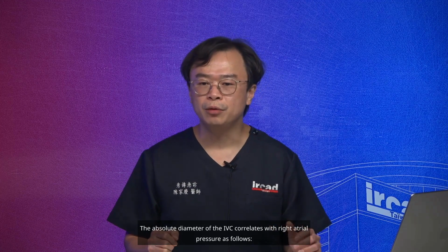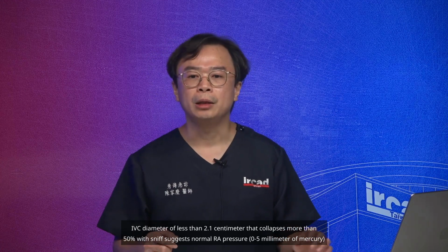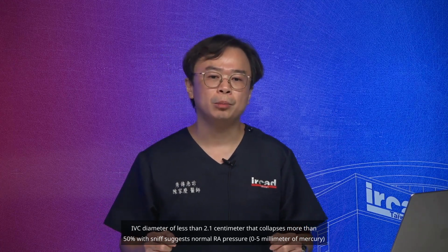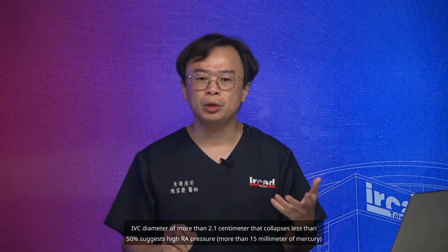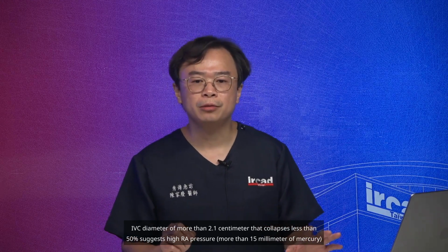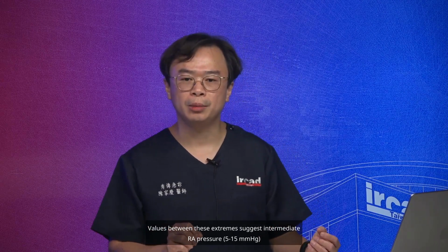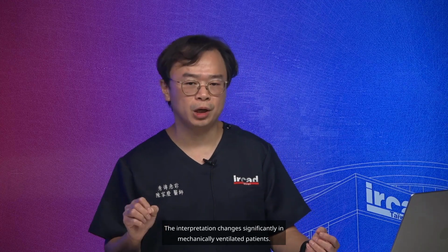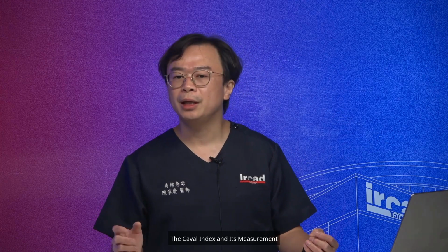The absolute diameter of the IVC correlates with right atrial pressure as follows. IVC diameter of less than 2.1 centimeter that collapses more than 50% with sniffs suggests normal RA pressure, 0 to 5 millimeter of mercury. IVC diameter of more than 2.1 centimeter that collapses less than 50% suggests high RA pressure, more than 15 millimeter of mercury. Values between these extremes suggest intermediate RA pressure, 5 to 15 mmHg. Remember, these values apply to spontaneously breathing patients. The interpretation changes significantly in mechanically ventilated patients.